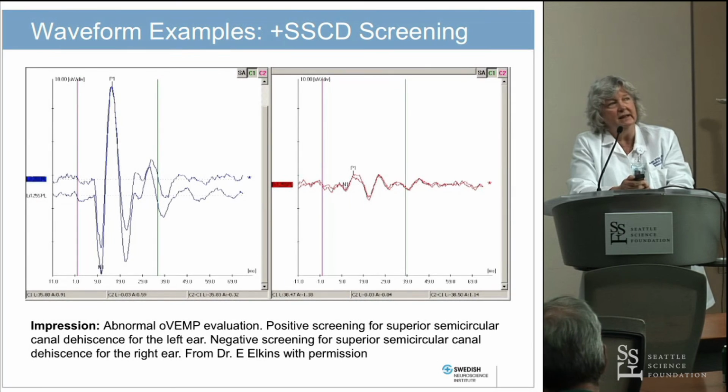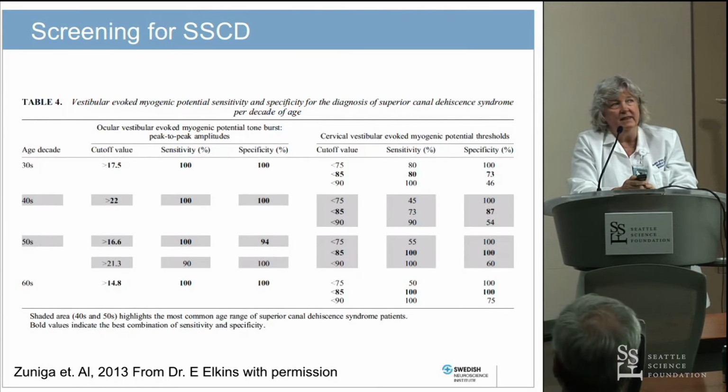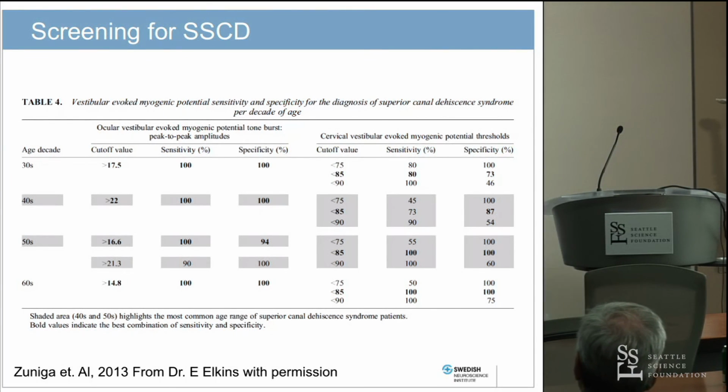And if it's really big like that, you've got a probable dehiscence. It's pretty clear cut when it's there. It just jumps right out at you. This is some interesting data. I'm sorry it's so small. Didn't realize it would come out small.